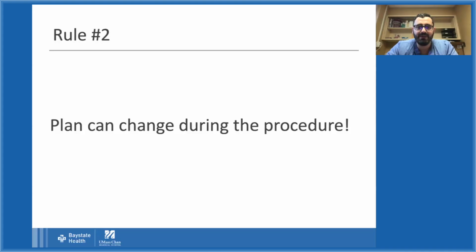Either the polyp cannot be removed with ESD, technically very difficult, or if I set up the patient for EMR and then I go there and I see the polyp is really nasty looking, there might be cancer. And so I always change the plan. I always tell my patients, yes, we will decide on this, but please keep in mind that the plan might change during the procedure. And frequently it does.